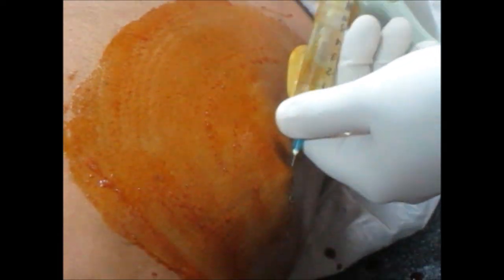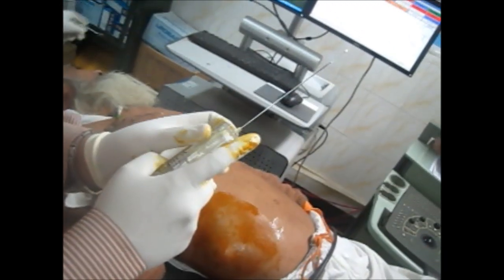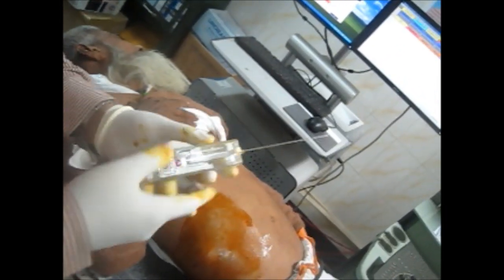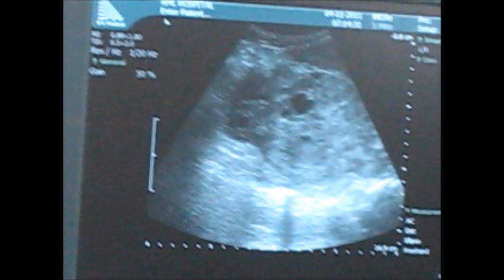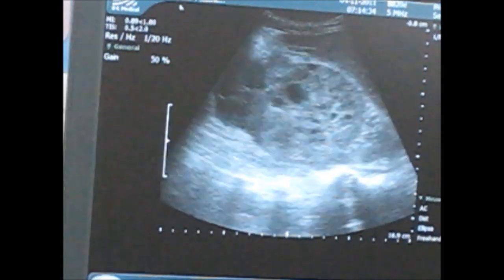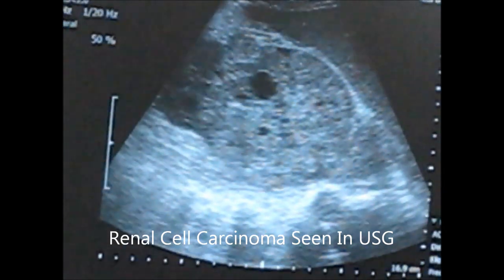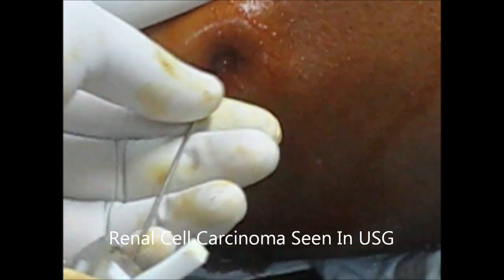This is a patient with renal cell carcinoma and we are going to show how to take the biopsy in such patients. We are taking a biopsy with the true-cut biopsy needle — basically this is a gun — and we will do it under the guidance of ultrasound. You can see the RCC of the kidney.